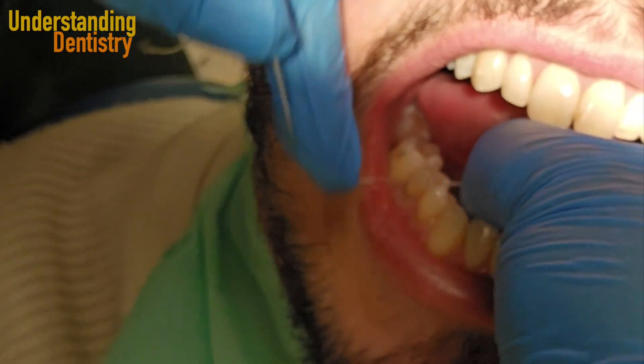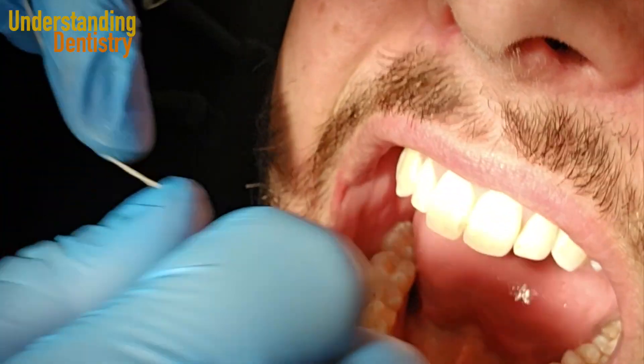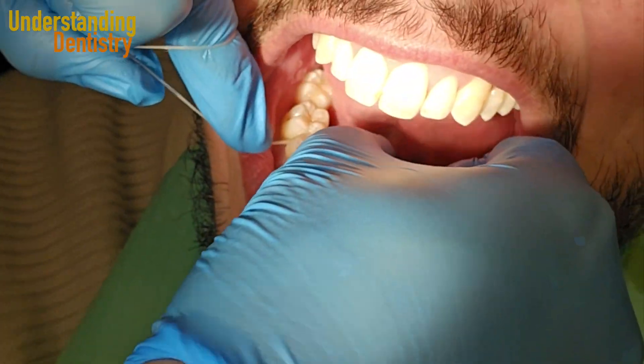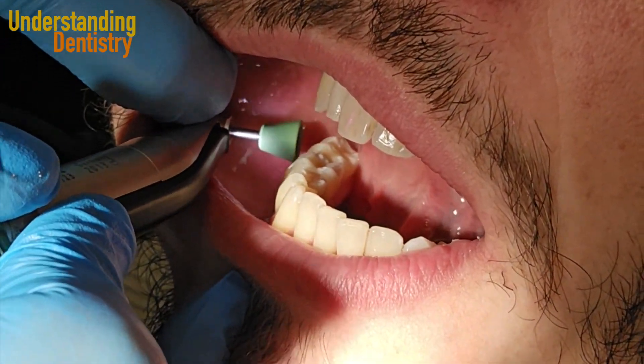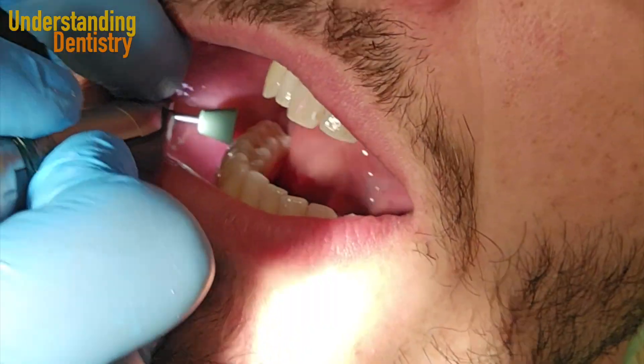Now adjusting the contact points — always floss to make sure that the contact points of your restorations are good. Of course, here we are talking about Class 2 restorations.